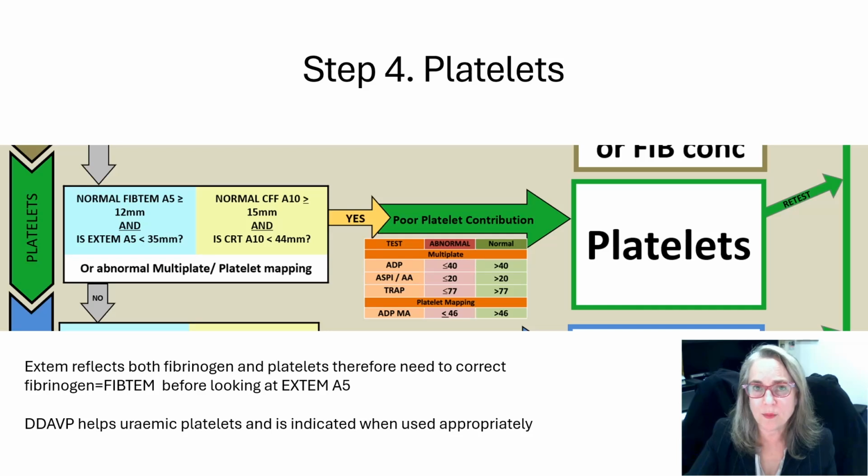And in the middle is a little schedule we've devised to look at the Multiplate, which is a lab test we can send up. Often we do it preoperatively. It does take about half an hour to come back, but it could save you giving platelets or point you in either direction.